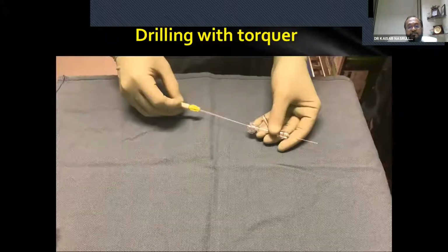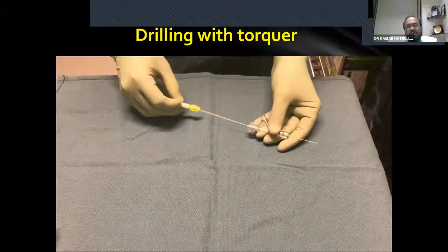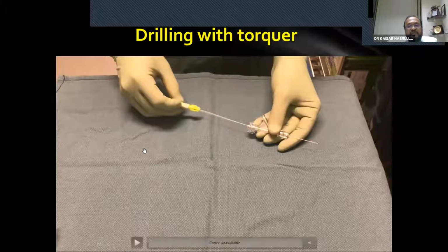Now some maneuvers. You can see this is drilling with a torquer. There are certain maneuvers: one is drilling, one is the penetrating method, the torque and feedback method when you use Gaia wires, and the sliding method. So let's start with the drilling method with the torquer.